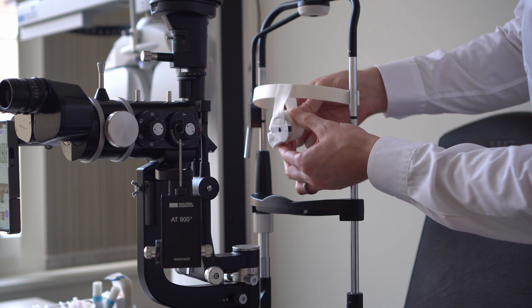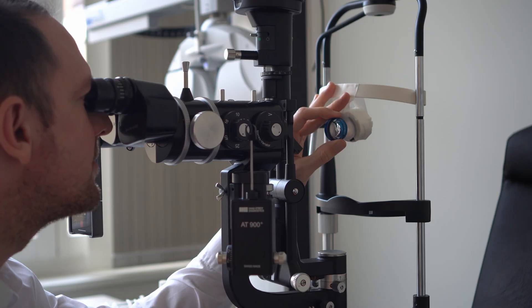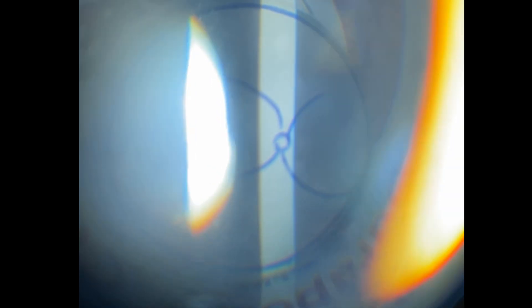Now to practice your fundus exam, take the model you just made and tape it to the headrest of your slit lamp — you should still have one of the three strips you set aside before. Then use your indirect lens to look at the retina and practice examining the different parts of it. Use it to figure out what happens if you move your lens versus what happens if you move your slit lamp in different directions. Try to see how far out you can get into the periphery and what you have to do to get there.